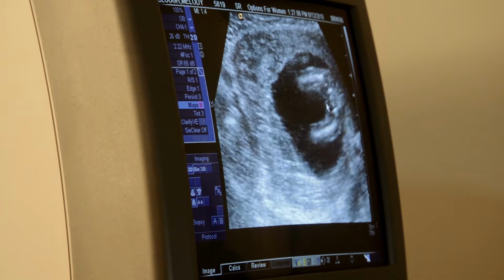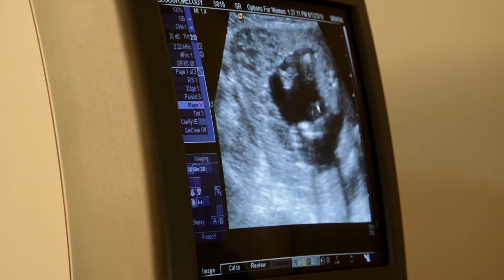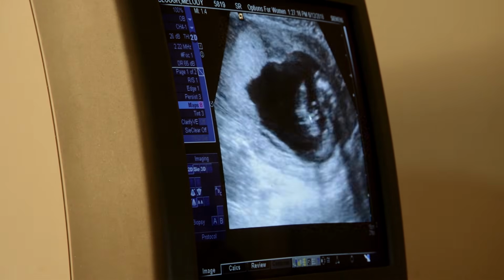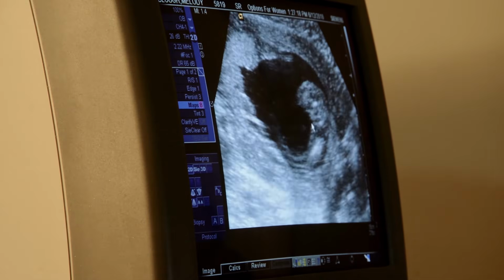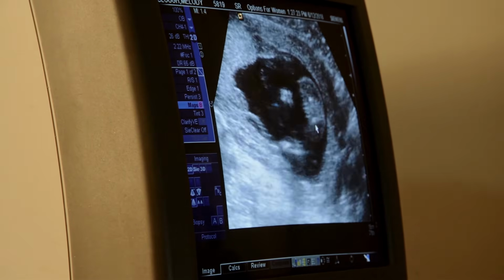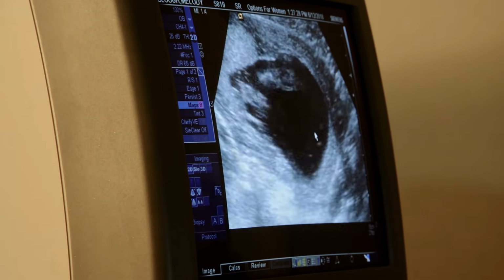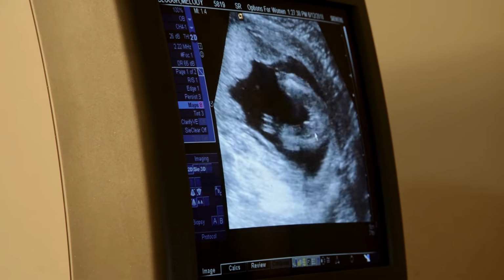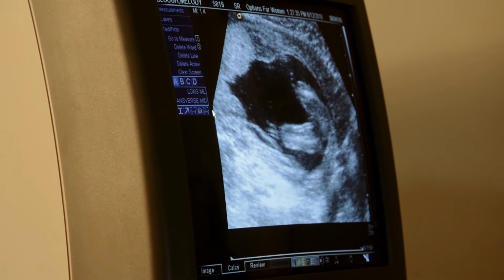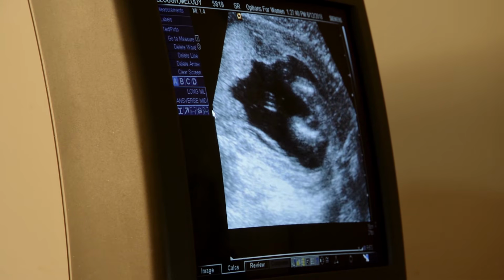If this girl or boy would hold still, I could tell. Come on. Do you have a preference? No. Oh my goodness. What's wrong with you? This won't let me see. And crying. All right, I'm going to freeze this, and I'm going to send it back because I think I got a peek, but I got to look.